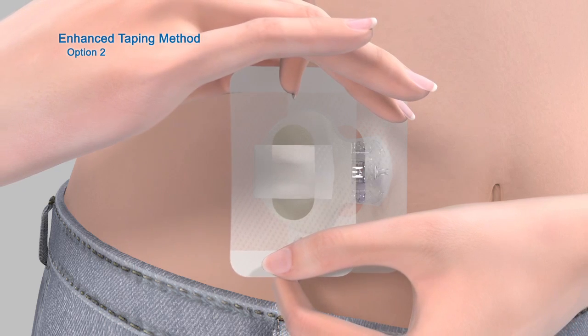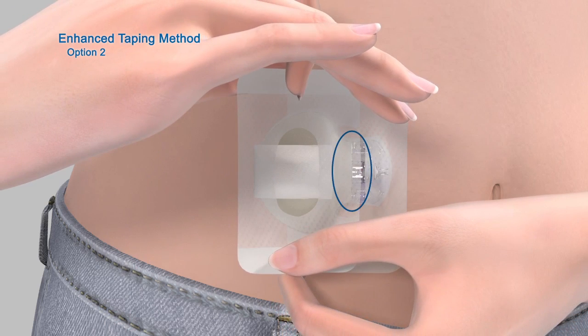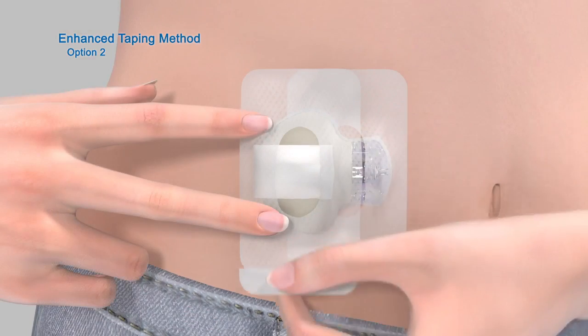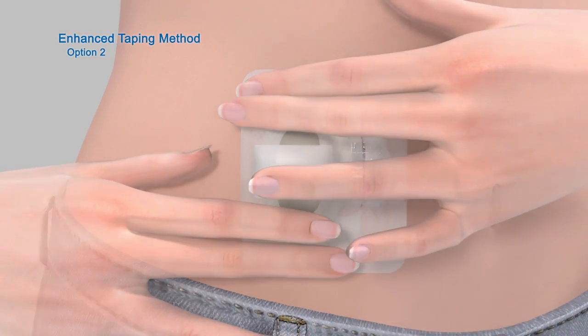Apply one side of the overtape so that it covers the connection between the sensor and transmitter, and apply the other side of the tape so it covers both the back of the transmitter and your skin. Smooth down the tape on your skin and transmitter to reduce air pockets. Now remove the paper backing marked number 2 and press the remaining overtape against your skin.